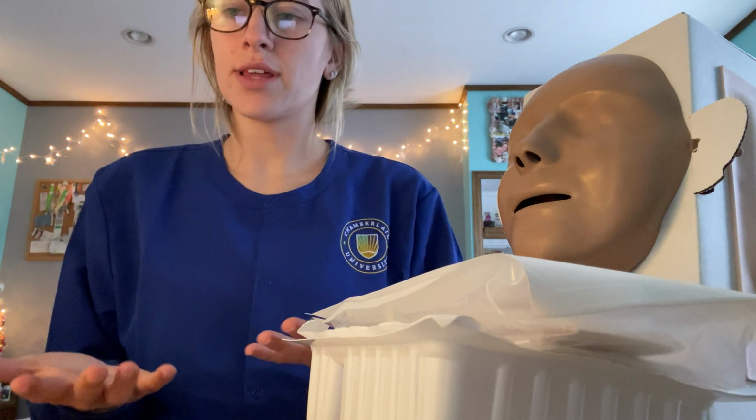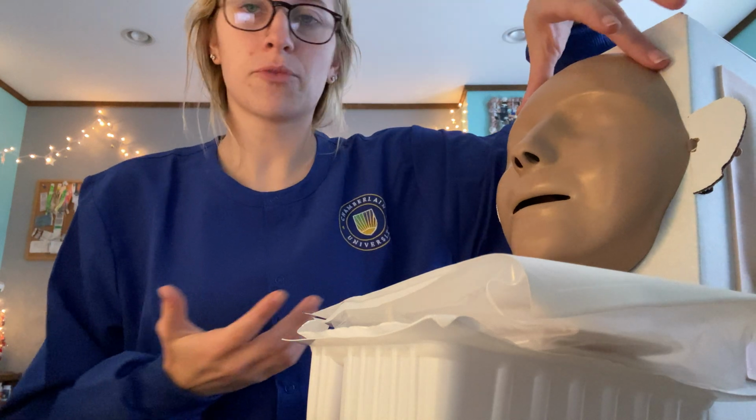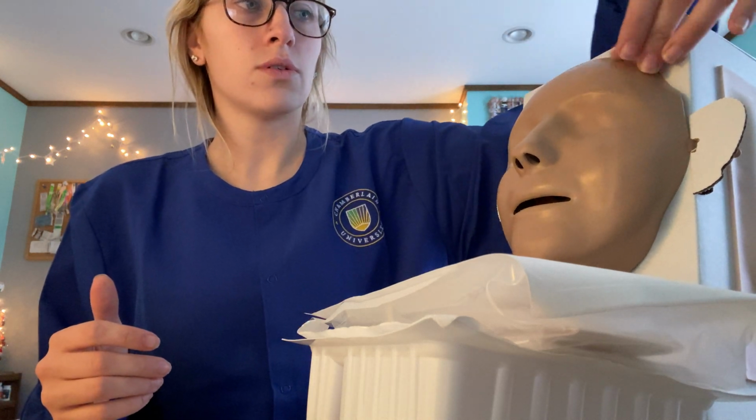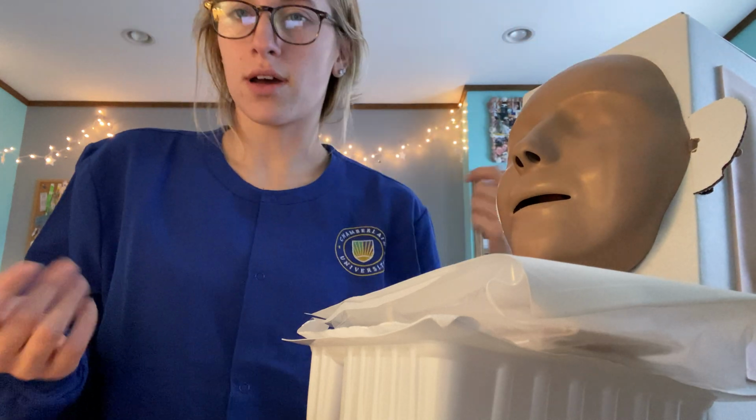And then I will make sure that I always provide privacy before I do anything because I want the patient to feel comfortable during the whole procedure. Then I also want to verify my provider's orders and make sure that I'm doing the right thing for my provider.